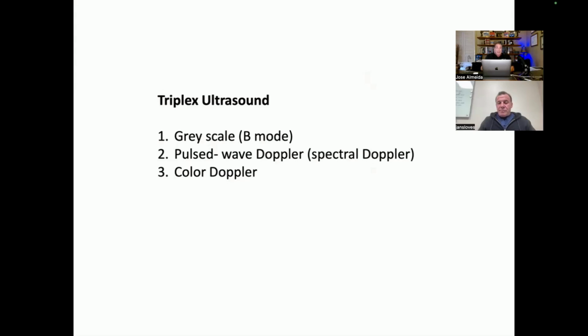And the third would be color flow, and assignments of red and blue color. People think that arteries are red and veins blue. So we typically assign the color in that fashion, but it doesn't mean that, it's just a color direction. And then the color characteristic can reflect higher or lower velocities based on the actual depth of the color.